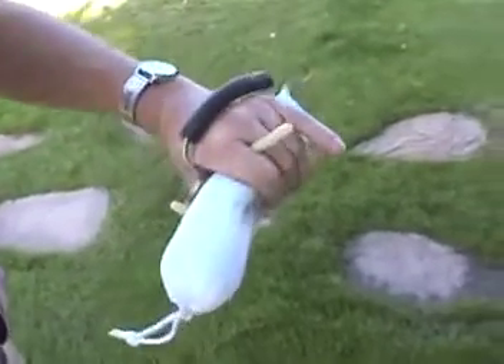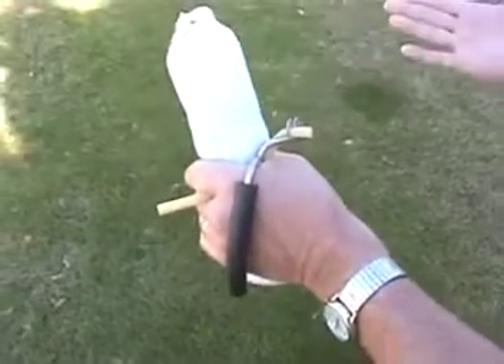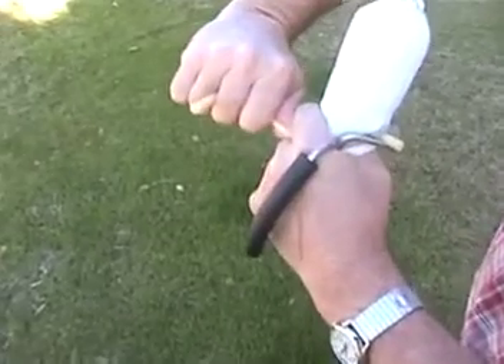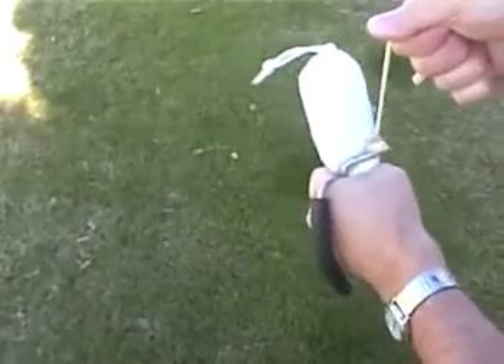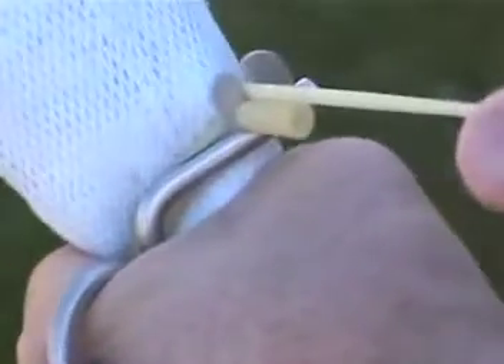The free end is between the fingers, ready for the other hand to grab. You want to apply it down low as possible. Reach around with the other hand, grab the end of the tubing, get a good hold of it. Stretch it out tight until there's no free stretch left in the band. Pull it slightly downward all the way around through the fingers, keeping it stretched, back down into the notch on the top of the clip and into the right hand corner.